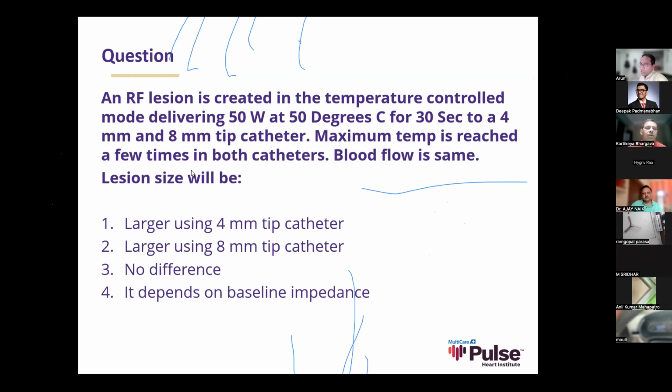So this is another question. Arun, let's clarify this more for the benefit of fellows, especially because most beginners believe that if you use an 8 millimeter catheter, you will get a larger lesion. So let's see what happens. One thing important to understand is that the wattage we program in the ablation system is not what is making the effect. What is actually delivered is what is important.